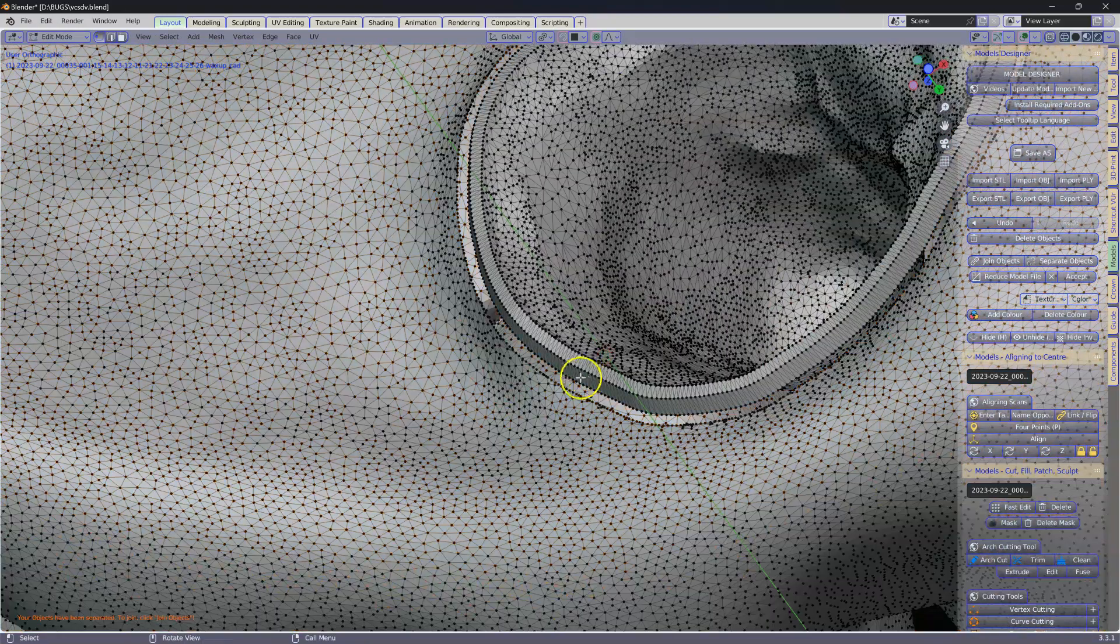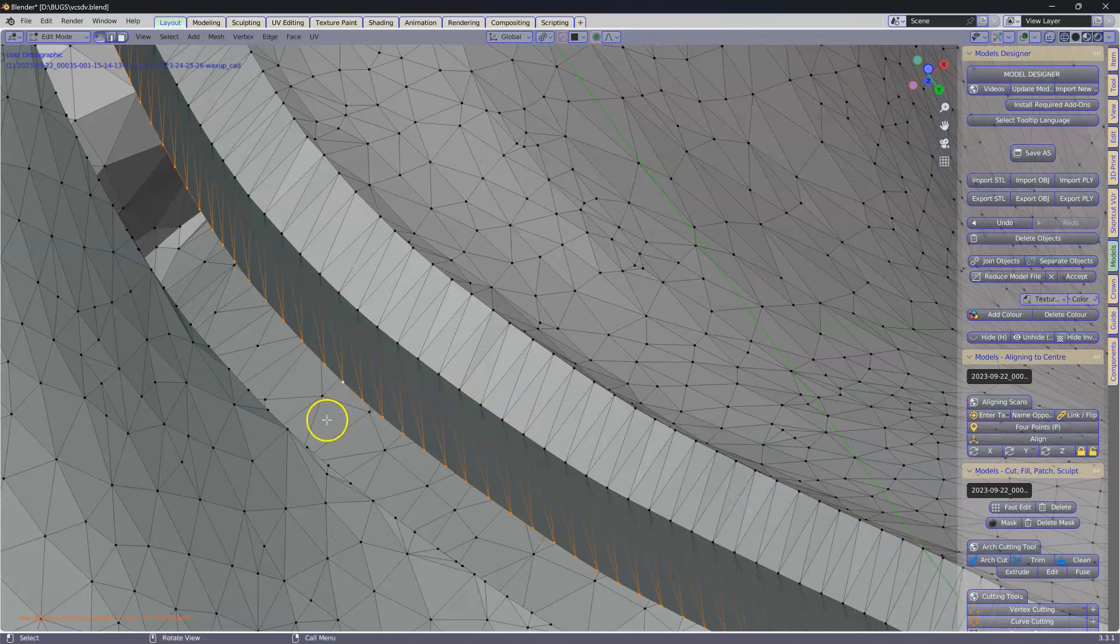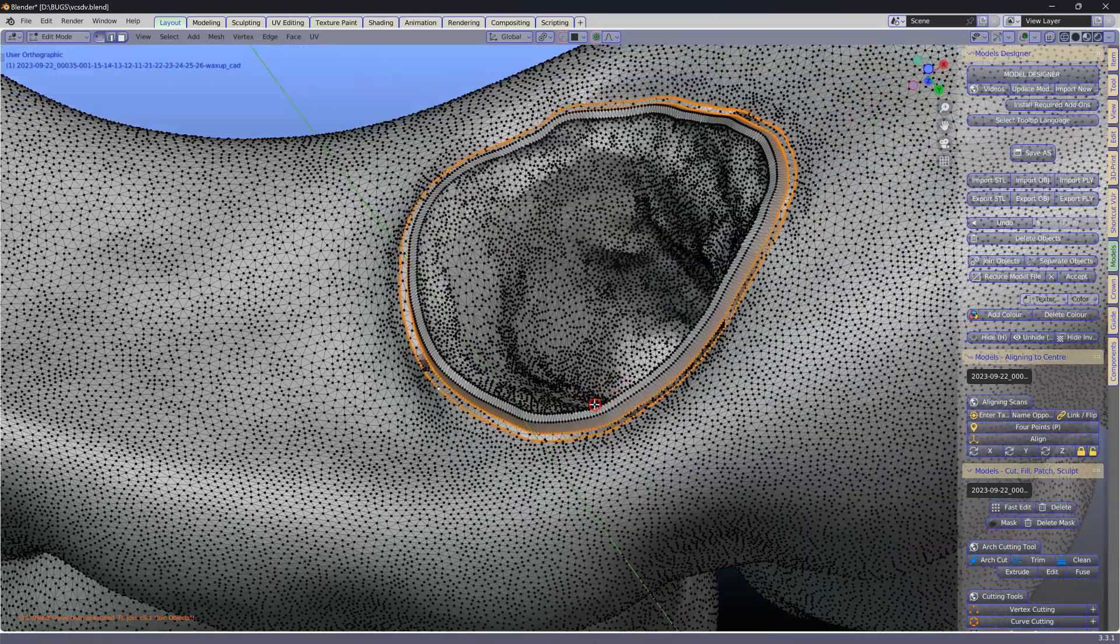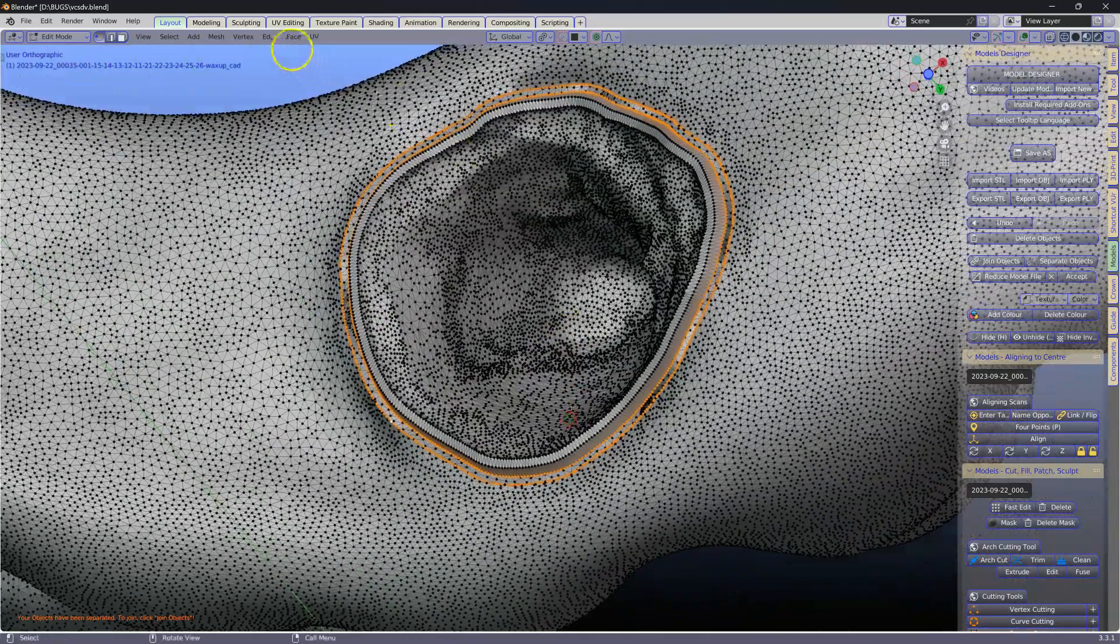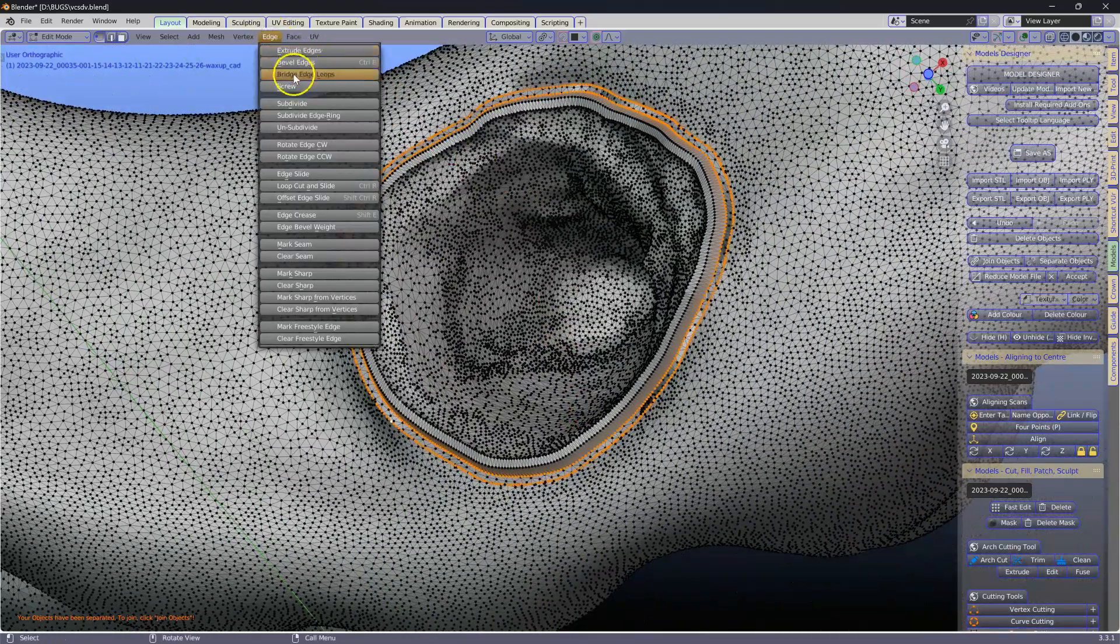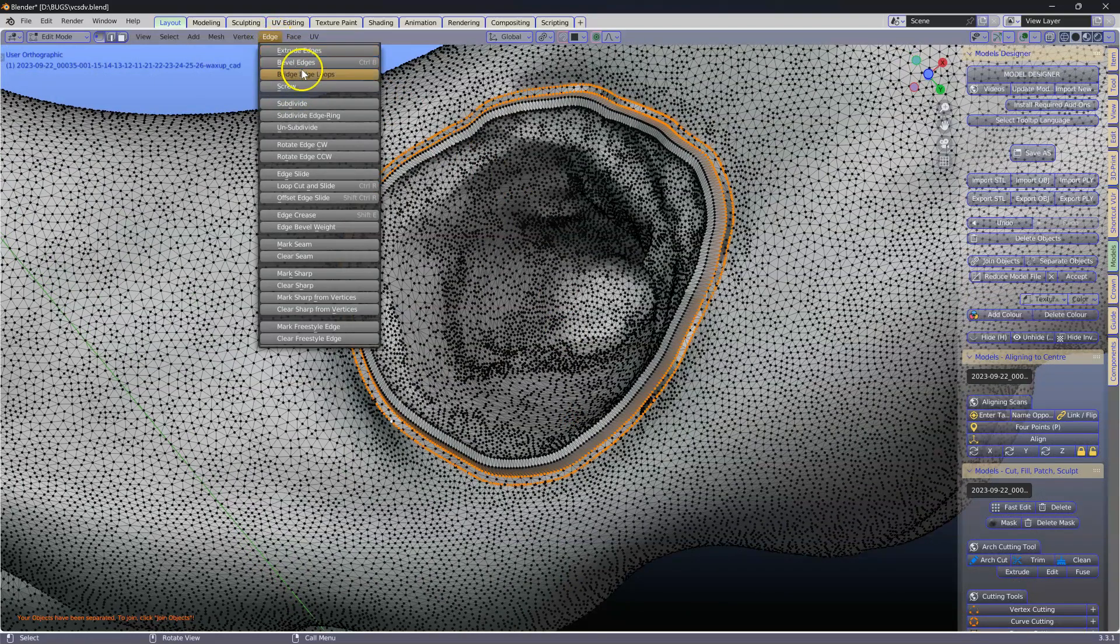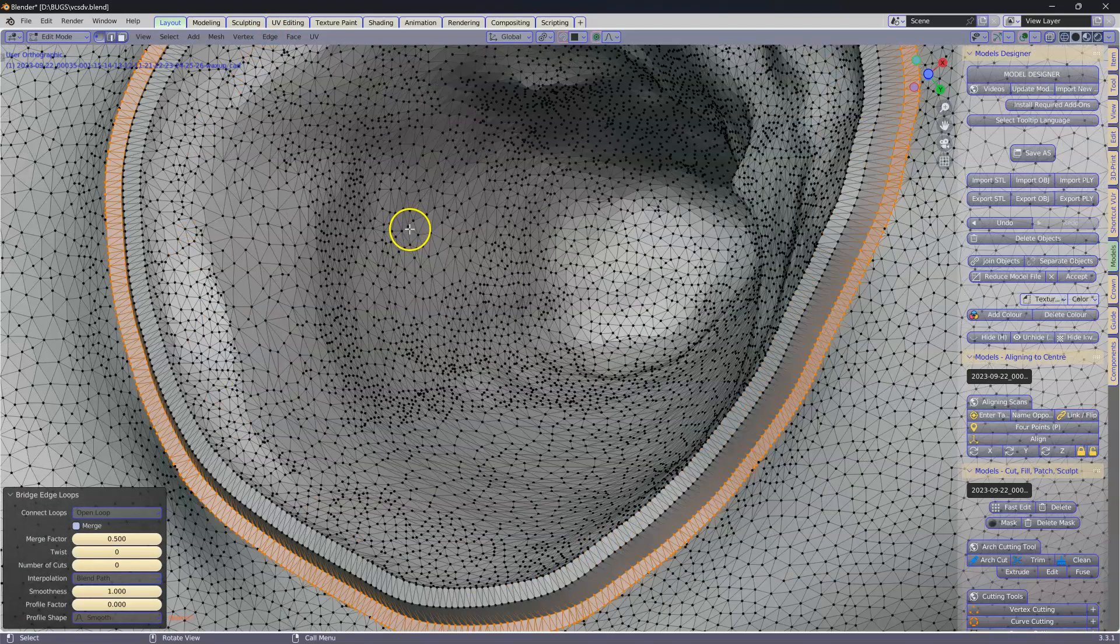Tab. Alt-A. Then we're going to zoom in. Alt-Left-Click there and Shift-Alt-Left-Click. Select both of these. Make sure they're both selected. Edge, Bridge Edge Loops. So edges, Bridge Edge Loops like that.